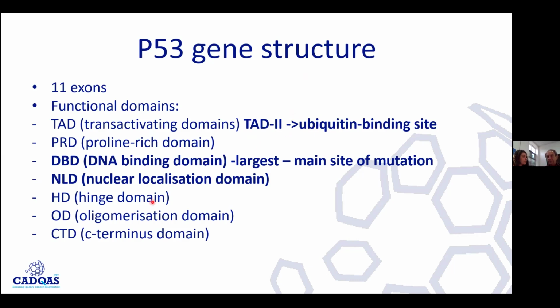And here is why in a mutant pattern we see this very, very strong staining, which normally, even if a cell is very upset and needs to repair DNA and therefore stop the cell cycle, never really gets to be black. These are mostly point mutations that induce this accumulation of the protein.